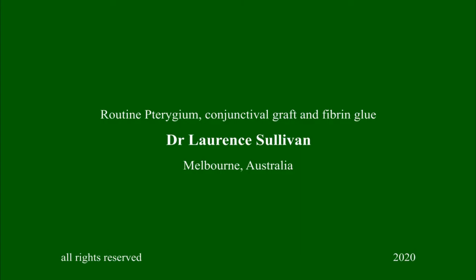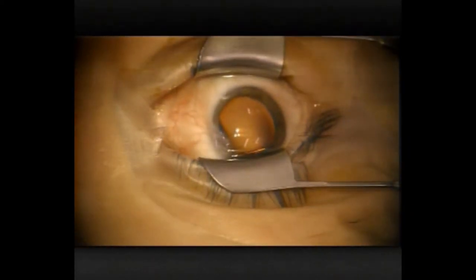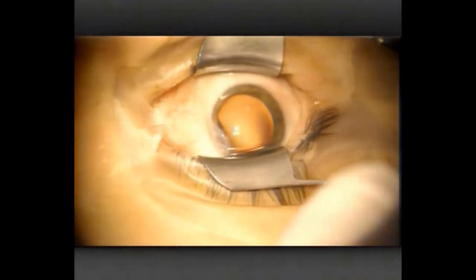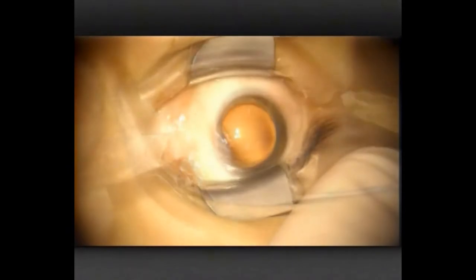Hi there, Laurie here again. This is just a routine case, but I realised when I look back at my videos that I haven't actually posted a pterygium case before. This lady had discomfort and irritation. Obviously this small pterygium was not affecting her vision because it's so far away from the optical centre of the cornea.